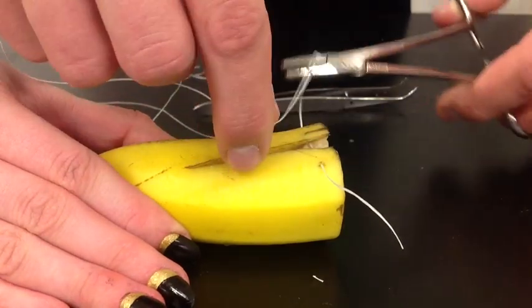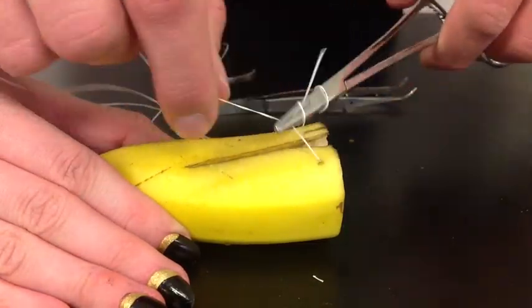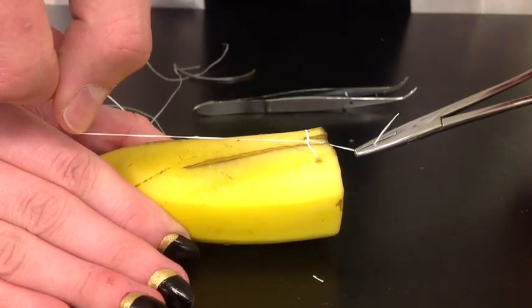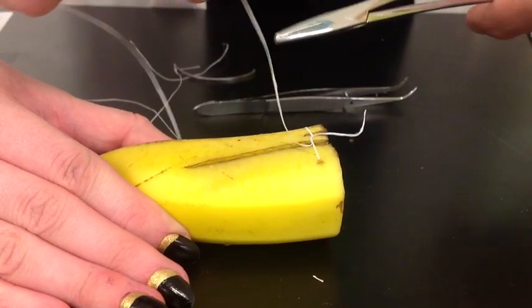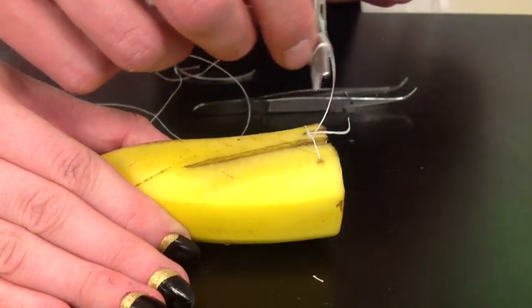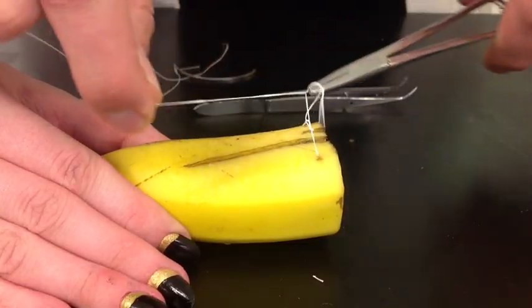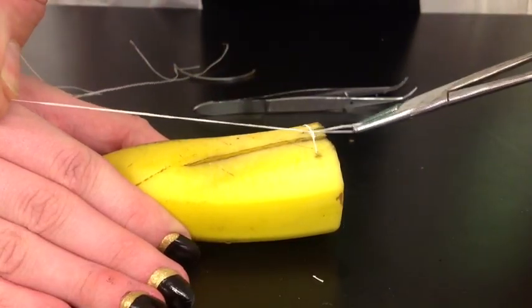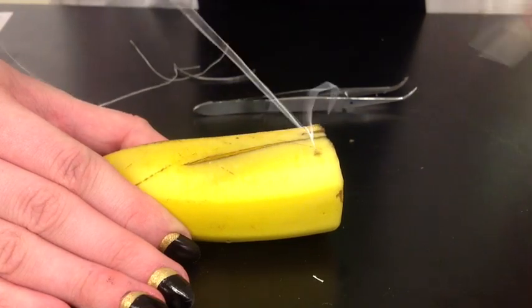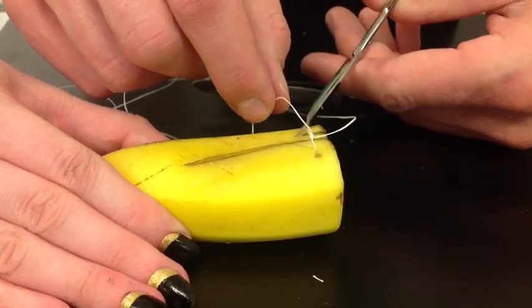As I'm doing this to tie the knot, I'm going to go over the needle holder twice. I'm going to grab the tail and pull with the wound. And now to do the square knot — I went over the first time, so I'm going to go under the second time. Wrap a couple times. Grab my tail and pull it through. I'm going to trim my tail so I have just a couple millimeters sticking off.